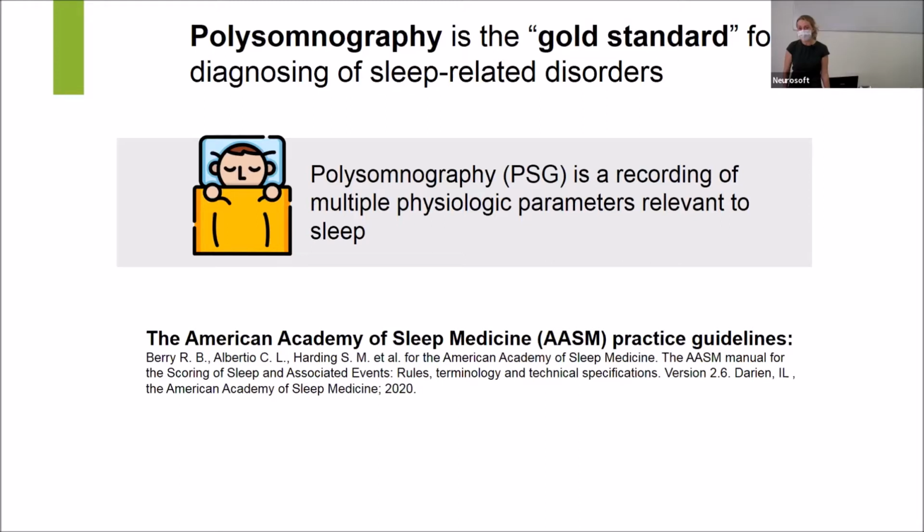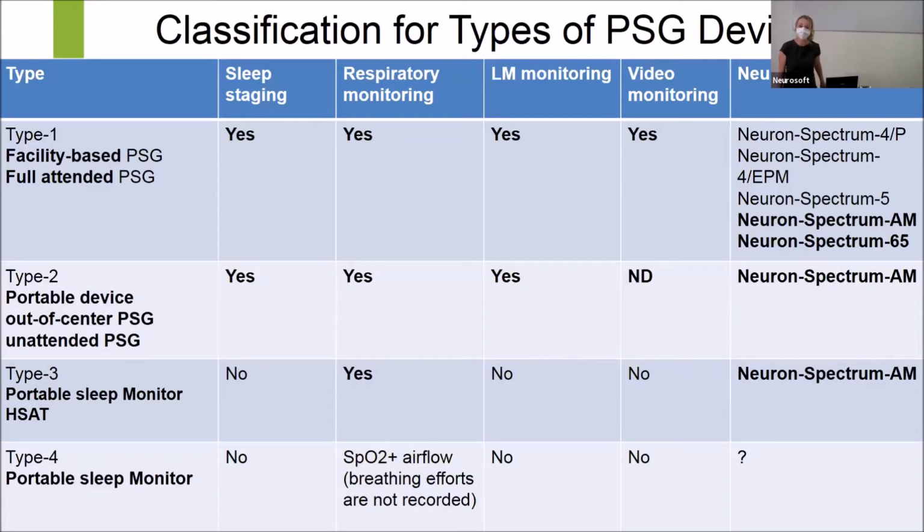complies with the recommendations. In accordance with these recommendations and this society, there are different types of PSG systems, and you can see this classification here. In accordance with this classification, there are 4 types of PSG systems.